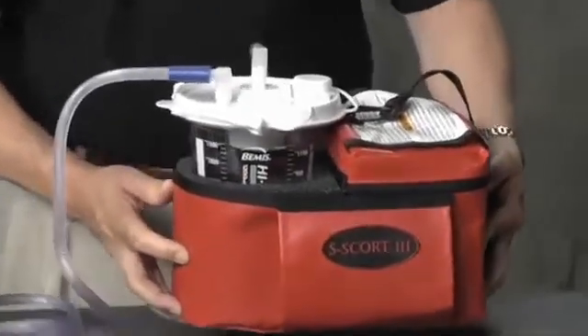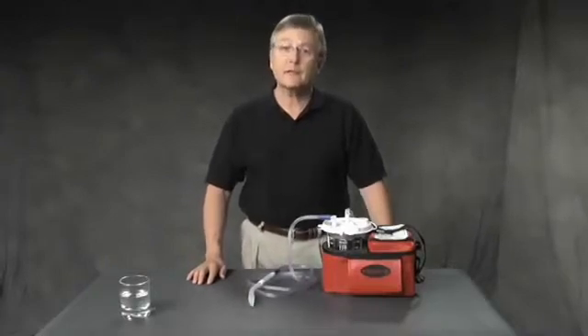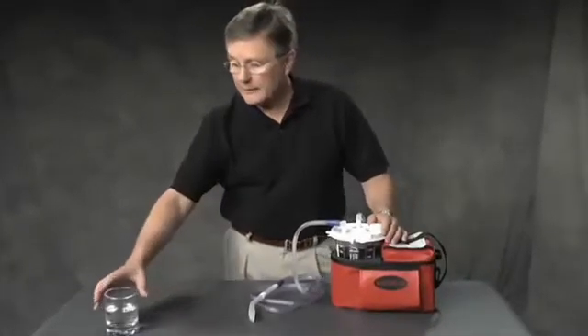Let's explore why the Escort 3 is so widely used. First, the primary purpose of field suction is to clear the airway, and that can become a challenge as fluids become more viscous and contain solids.